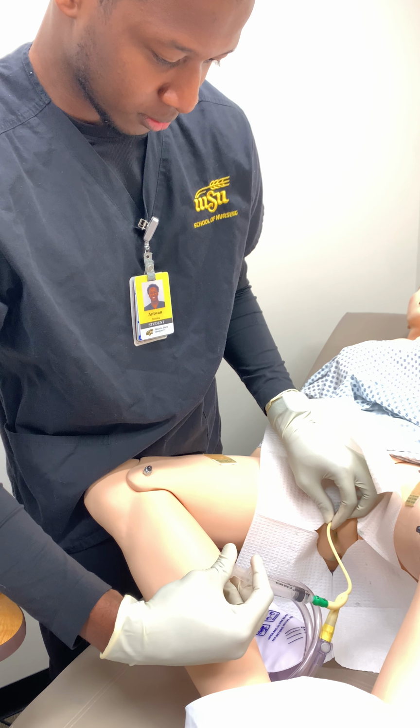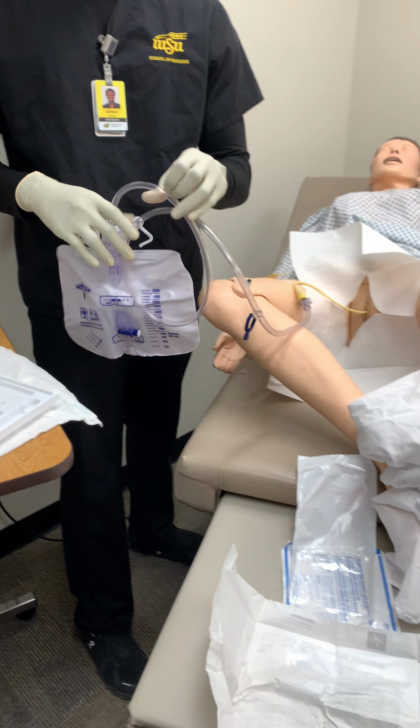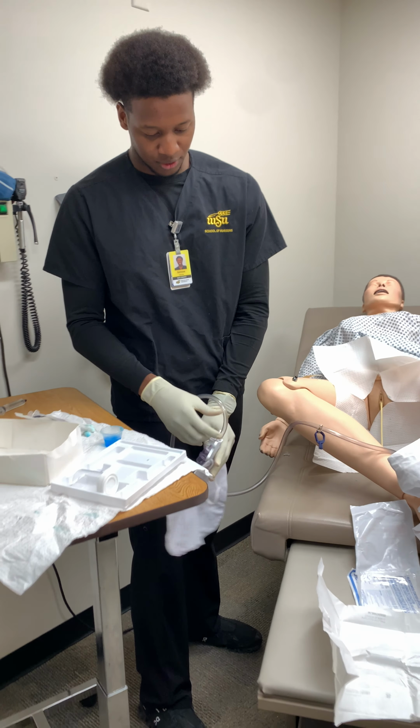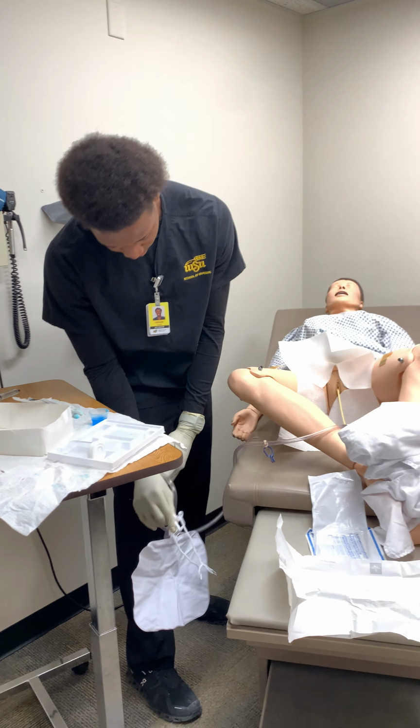In this case, if we remove it, we'll end up ripping the drape, which we are reusing. So I'll put my Foley bag to catch the urine on the part of the bed that cannot move, and I'll start cleaning up.